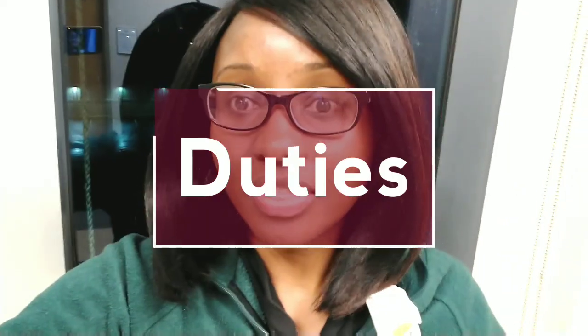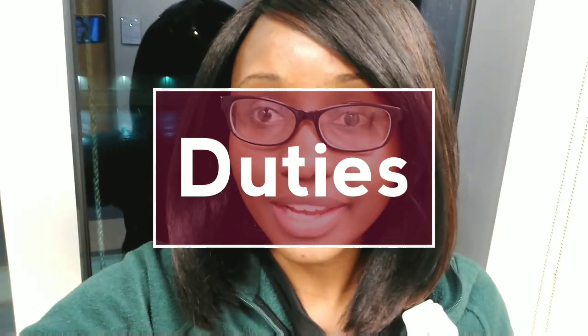The main thing that you're doing as a monitor tech is basically making sure the patients don't die. You're going to call the nurse if anything changes with the patients. You get a baseline rhythm of the patient, and if anything changes beyond that, then you have to call the nurse and let them know.